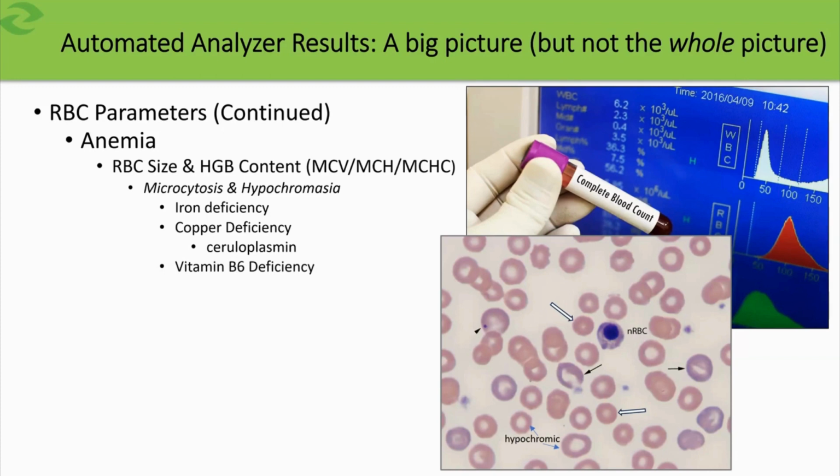Vitamin B6 deficiency results in a microcytosis. Vitamin B6 is required for heme synthesis. So because there's not a full complement of heme, which determines when cell division should end, hemoglobin content reaches its maximum concentration. Because that heme synthesis is impaired, the developing erythrocytes undergo additional cell division, resulting in these microcytic cells. They may or may not be hypochromic with the vitamin B6 deficiency.